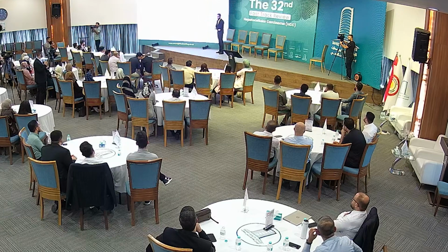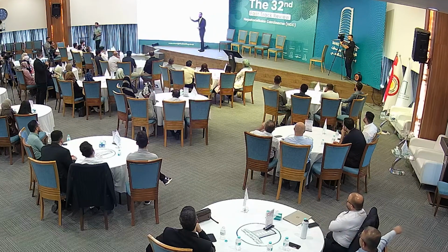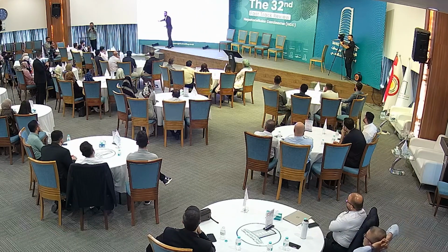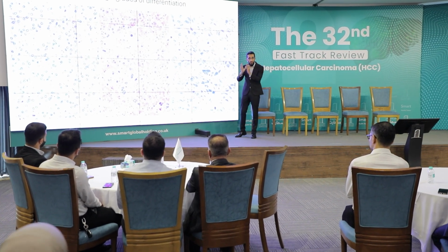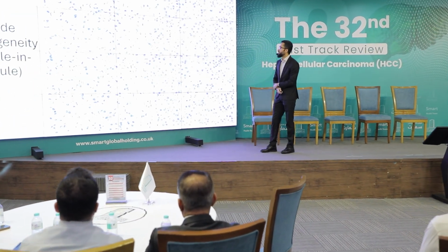How do we grade hepatocellular carcinoma? Well, there are 4-tiered systems and 3-tiered systems. The one that we most commonly use is a 3-tiered system. So you have well-differentiated, moderately, and poorly differentiated. When do we say well-differentiated? When it looks like a normal liver. In this case, it's difficult to distinguish from benign lesions, and we'll get to that in a moment. While for the poorly differentiated, it's difficult to tell that it is of liver origin. You know that it's cancer, but you can't tell if it's hepatocellular, and you need to do immune stains.